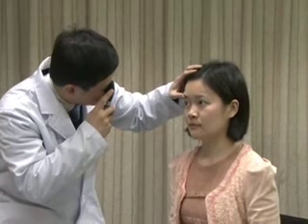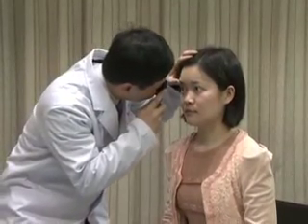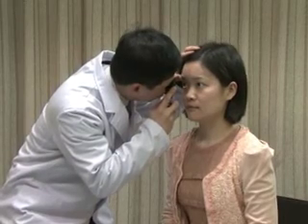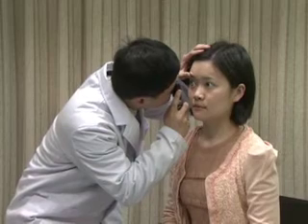To locate the optic disc, make sure to approach the patient about 15 degrees temporal to center. If you are unable to visualize the retina, you may make small adjustments in your angle relative to the patient's visual axis.